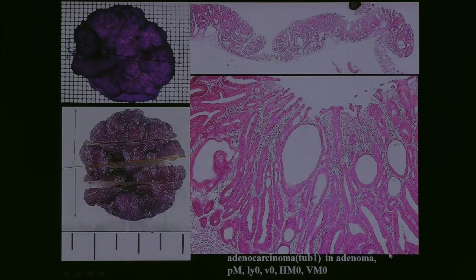The pathological diagnosis was adenocarcinoma in adenoma. The depth was intramucosal.